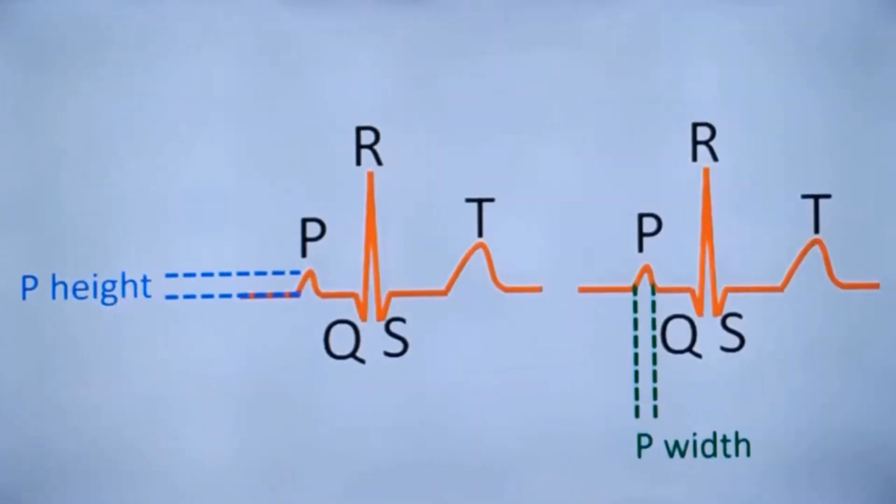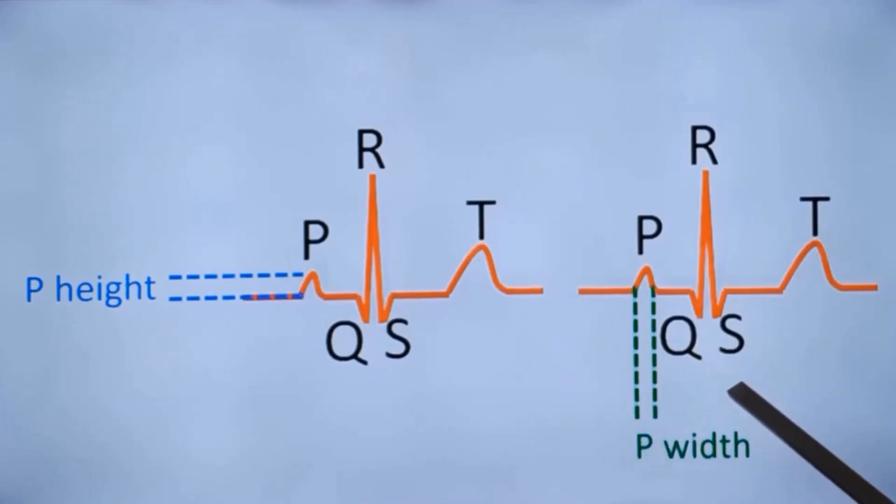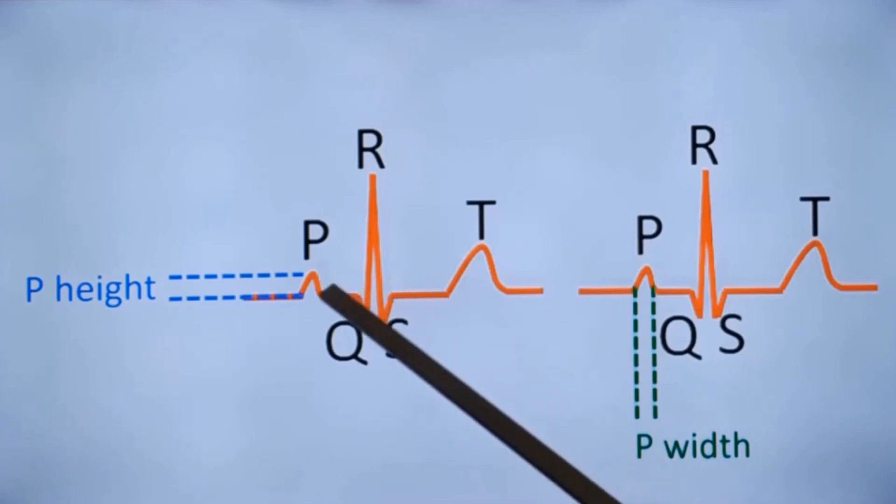Normal P wave dimensions are easy to remember. Both the height of P wave or amplitude of P wave and width of P wave are 2.5 mm in a standard ECG, meaning that an ECG recorded at a paper speed of 25 mm per second. The P width of 2.5 mm will correspond to 100 ms when you express as time. And if it is more than that, you can say that P is widened and it occurs in left atrial enlargement. Height of the P wave more than 2.5 mm occurs in right atrial enlargement. If both height and width are increased, it is biatrial enlargement.